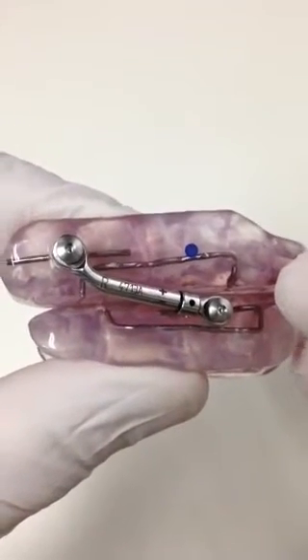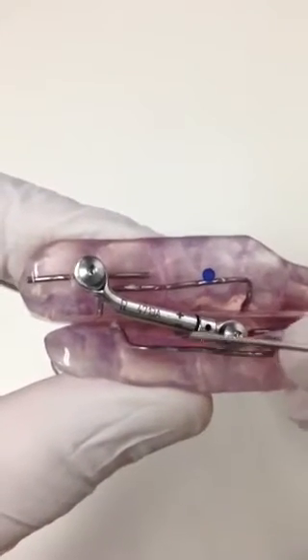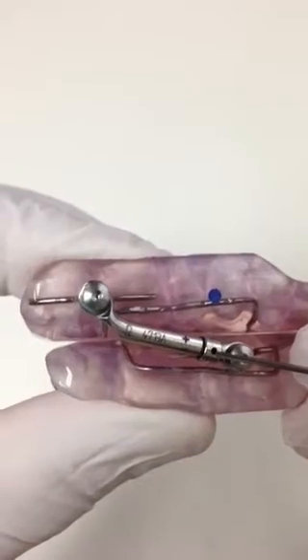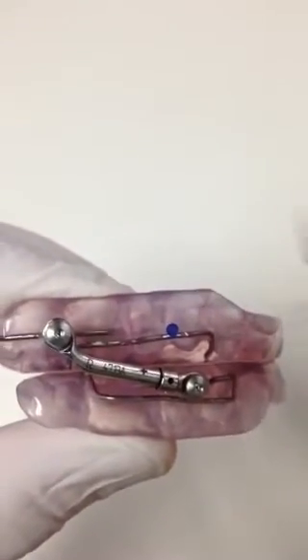This video will demonstrate the adjustment of the Herbst appliance. As you can see, there are four little keyholes that can be used to adjust it. It is adjusted with a pin such as this.